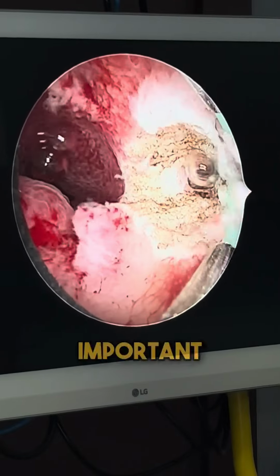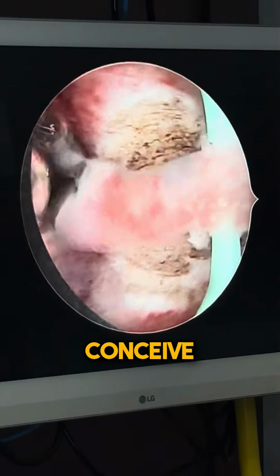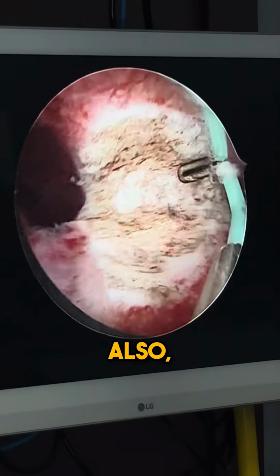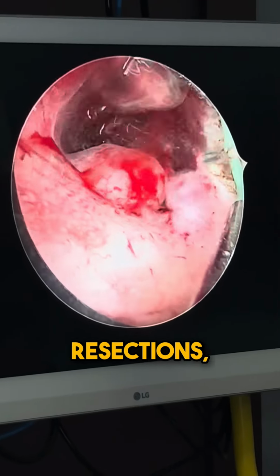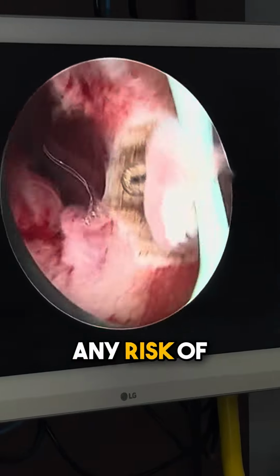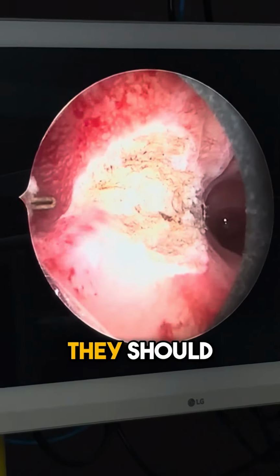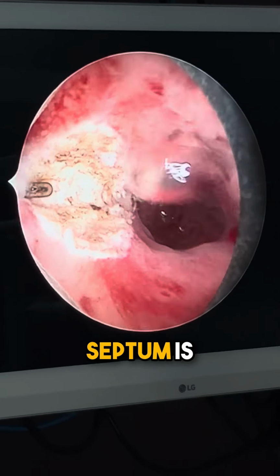Although the important thing to note here is, once we do this resection, we tell the patient to conceive only after 3 months, because that much time is required for her uterus to regain its normal strength. Also, in many patients where we have done massive resections, we advise them to go for C-sections at the time of childbirth to prevent any risk of uterine rupture, which may happen in certain cases. Although it is not a must, we do advise certain couples to undergo C-section at the time of delivery. You see how nicely the septum is getting cut now.